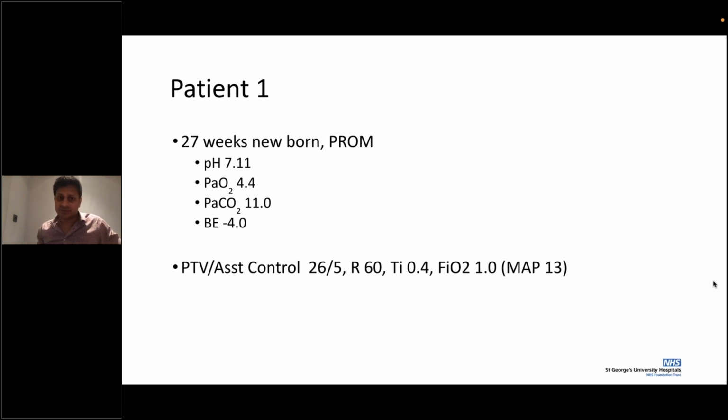And get an X-ray straight after connecting to high frequency. You want to make sure that your mean airway pressure is reasonable, that you're not over-ventilating, and not causing over-expansion.